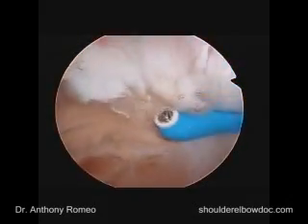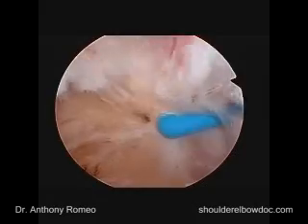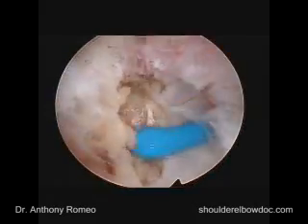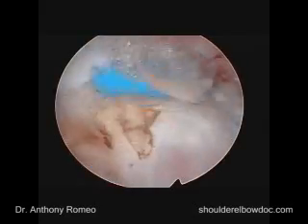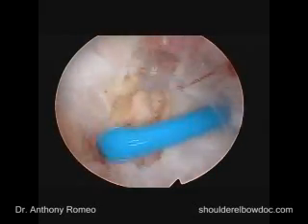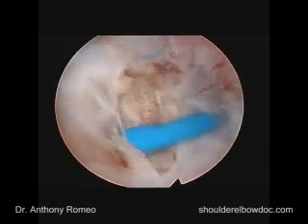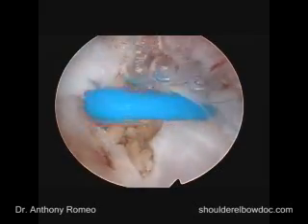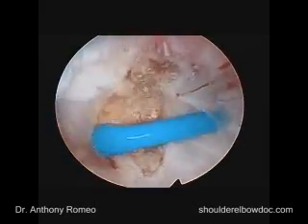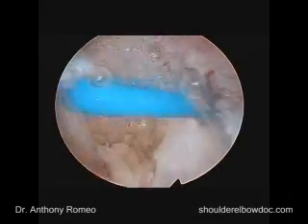This is the coracoid process, which is right behind us here. We'll clean this off just to make sure we have our landmarks well-defined. In some patients, the coracoid process can be quite prominent, though it doesn't appear to be that way arthroscopically or on x-rays here. But if there's a hook or prominence in this area, or a minimizing of the space between the subscapularis and the coracoid process, a coracoidplasty can be performed through this portal.